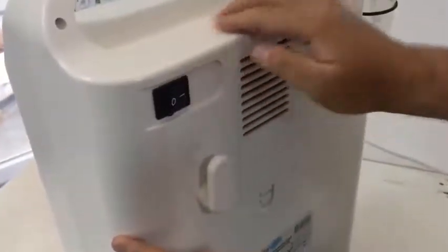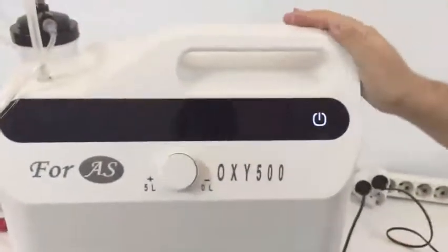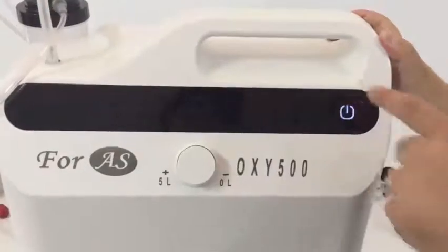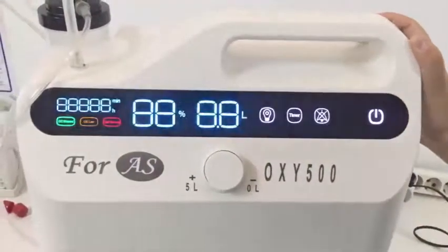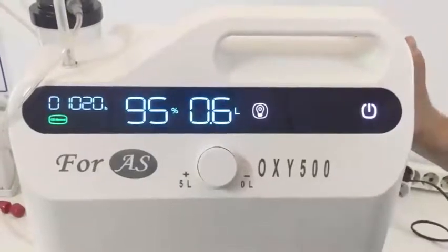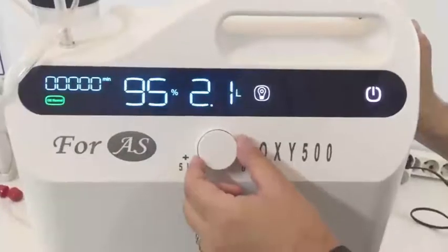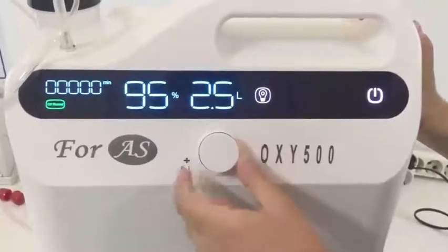In a short while, the device is going to be adjusted to the oxygen level requested. You can adjust the amount and flow of oxygen using the button — you can increase and decrease it while using the device. When the oxygen normal lamp is on, it means the device is ready to operate properly and is giving the adjusted amount of oxygen to the patient.